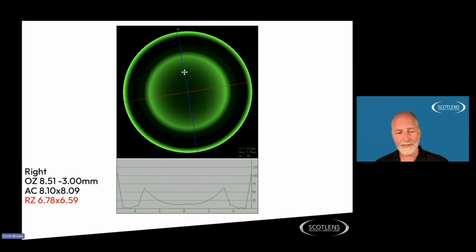The other thing to notice, if you look at the lens figures, is the alignment curves, so the curves that are out in the periphery are almost identical, 810 and 809 with this patient. And actually the astigmatism is quite central, so it's just the reverse zone on this lens that's toric effectively, the peripheral curves. And this is why we want to measure for night lenses, we want to measure as big an area as possible because this lens is 11 mil in size.